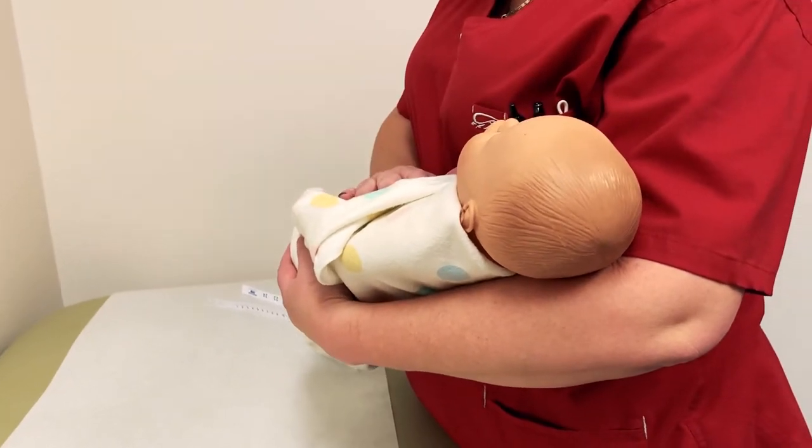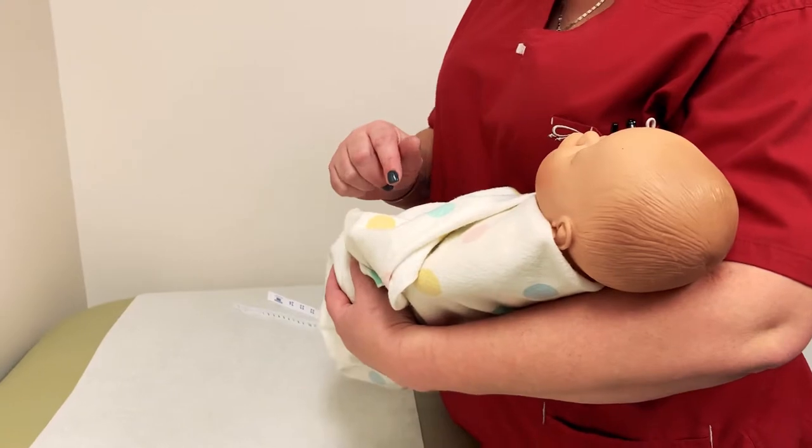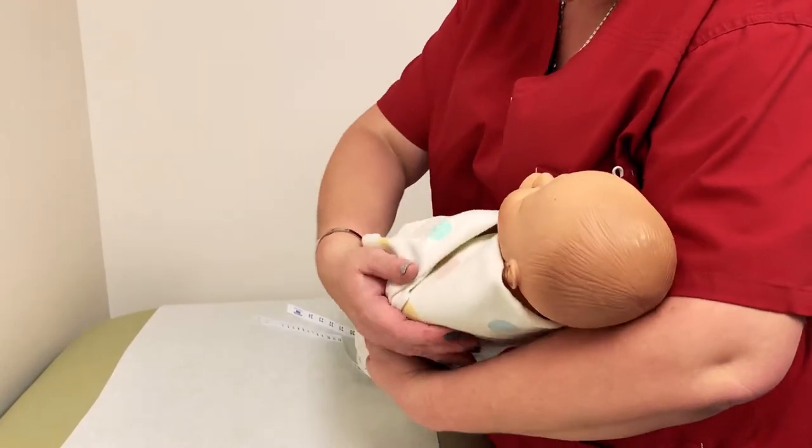Hey everyone, so we're going to learn today how to measure the head circumference, the length, and the weight of an infant for their well child checks.